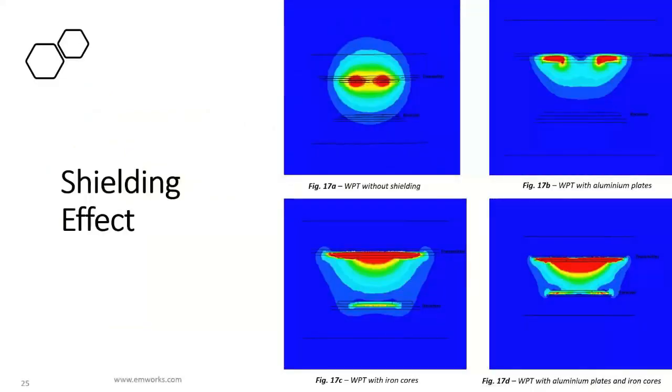Now let's investigate another factor that can affect the efficiency of the wireless power system. Shielding has an important impact on the magnetic field strength and orientation. We can see the difference in the magnetic flux plots in the 4 figures of this slide. The magnetic field is symmetric around the transmitter coil. An important field is linked to the air in case of a wireless power transmitter without shielding, so the coupling is weak in this situation. When the aluminum plates are added, a low field is now oriented to the receiver coil. Since the air gap is a bit high, the field couldn't reach the secondary coil.